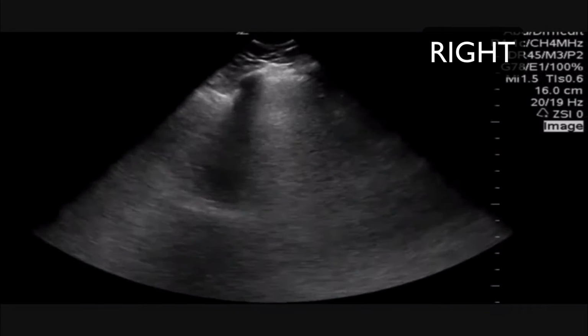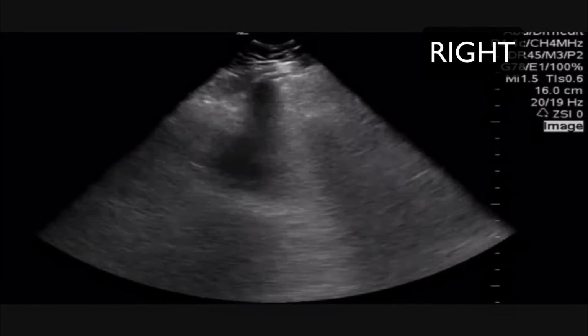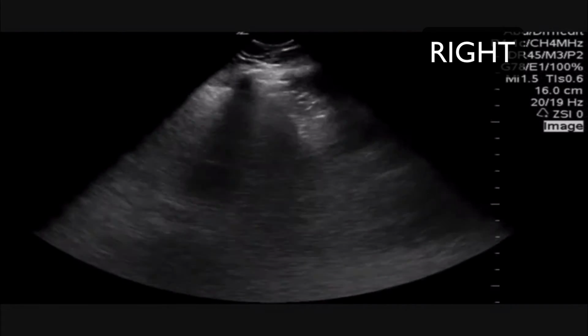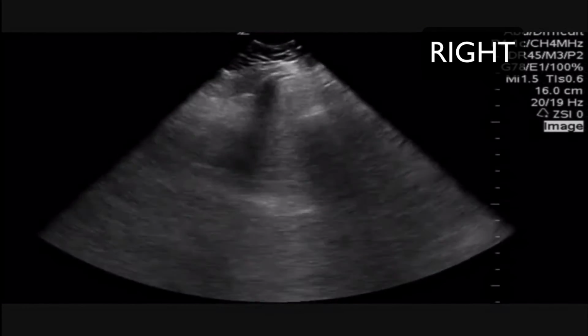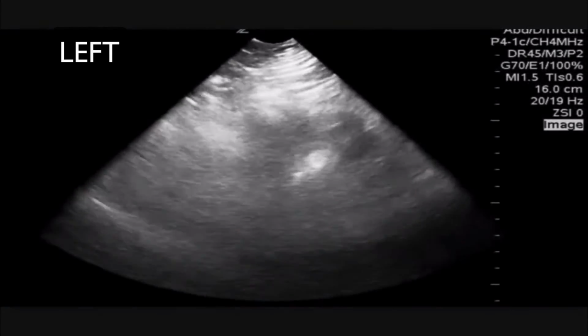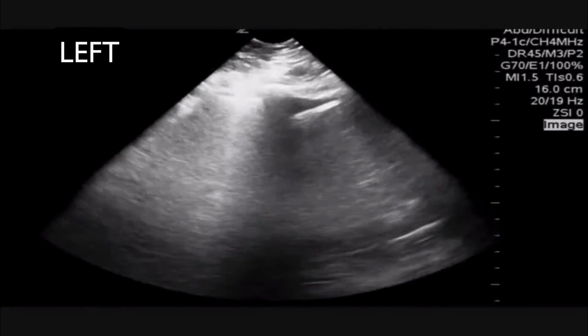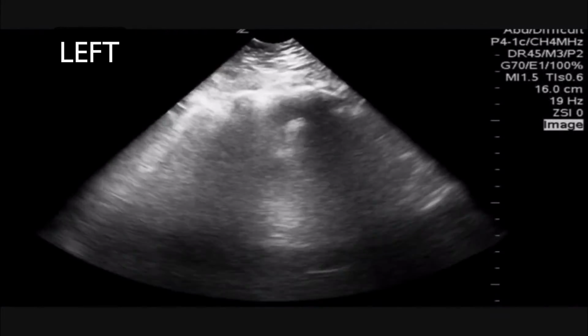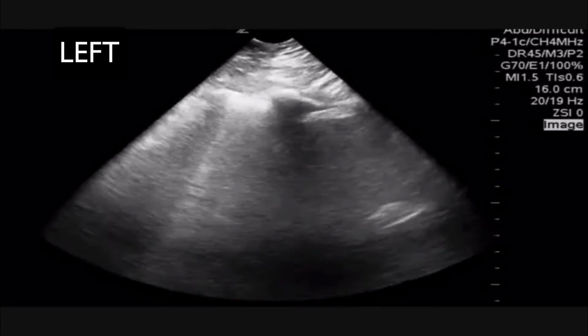The first thing I like to look at are the lungs in the acutely dyspneic patient, and this is what we see. These are B-lines, so you can see straight vertical lines like flashlights going from the top pleura all the way to the bottom of the screen. There's definitely more than 3 to 5 in a lung field, so she has interstitial fluid, and I'm thinking this is cardiogenic pulmonary edema, especially when I see that it is bilateral.